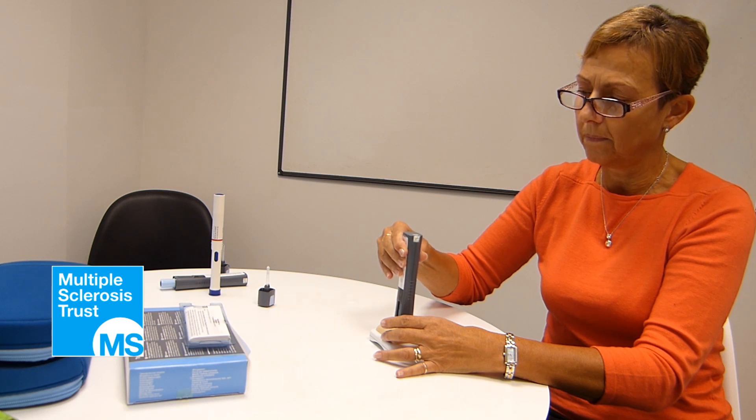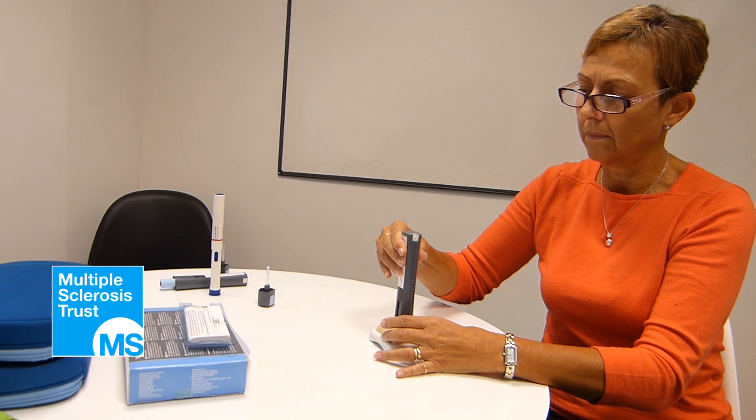A clicking will indicate the injection has started. The clicking will last about 5 seconds. Continue to hold until the clicking sound stops and green tick marks appear in the injection status window.